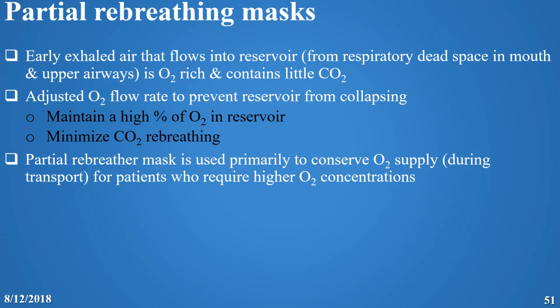That's the good news, because the air in the upper airway is not involved in gas exchange, so CO2 has not moved from the blood into it, unlike the air in the alveoli. Once the baby breathes out, this goes to the reservoir. Once the reservoir is full, the air coming from the alveoli, after the dead space, moves out. Therefore, the air in the reservoir has minimum CO2.